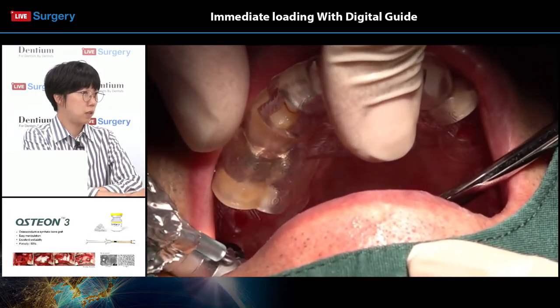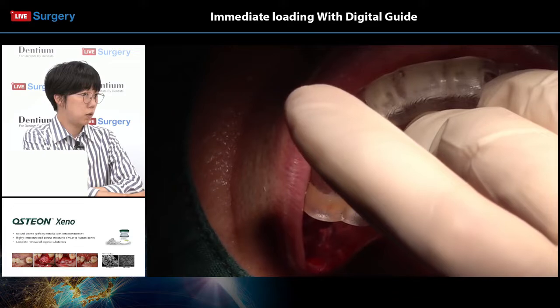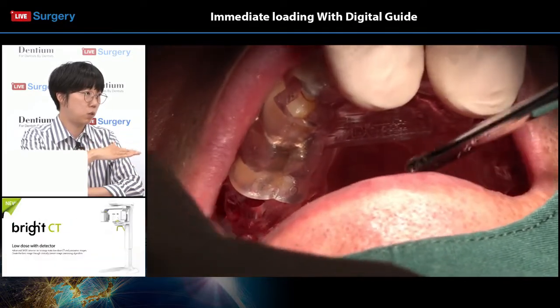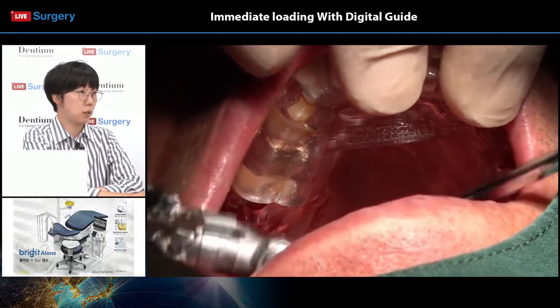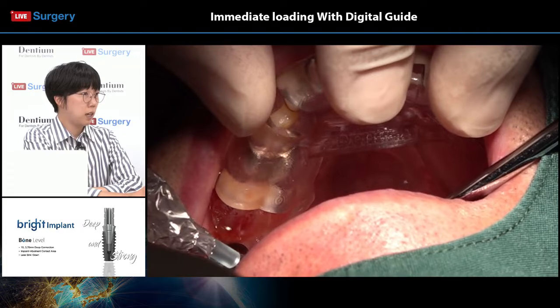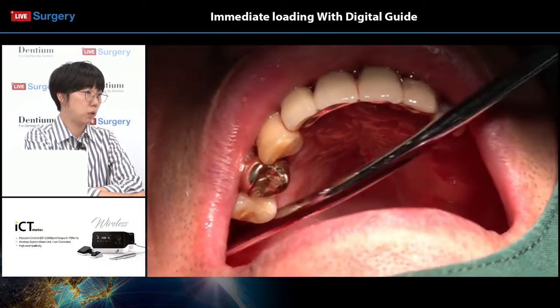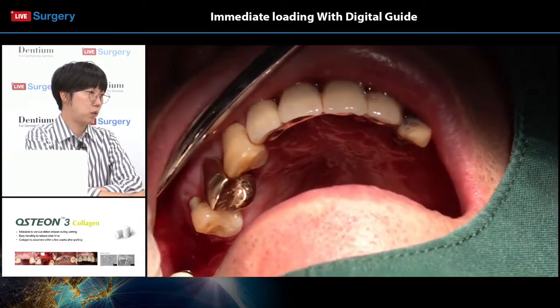And as you've seen now, Dr. Lee is pressing onto the stent firmly with his left hand. Without doing this, the stent can move in an anterior-posterior way. It can sort of jiggle around in the mouth. So it's very important to constantly check the stent is securely positioned within the patient's mouth. Usually those windows that are positioned on the right canine area you're seeing now act as very good reference points, so please make sure your stent is always secured in the same position. Otherwise, we'll have implants positioned in the wrong place.